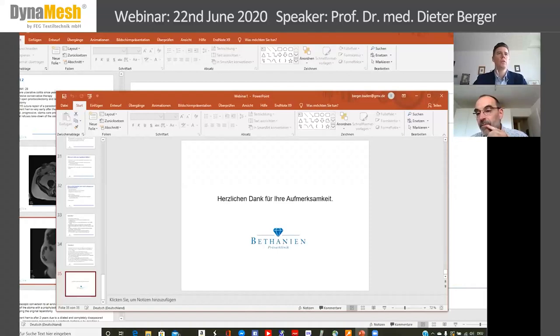A question from Ahmed Al-Wusaibi that was asked during your sandwich technique video, what type of mesh do you use? Since 2004, I use the DynaMesh IPOM, which is a PVDF mesh, a mesh of polyvinylidene fluoride, with a small amount of polypropylene on the parietal side in order to induce quick adhesion or incorporation into the abdomen. Okay, thank you. One more question from Hakan Gök.